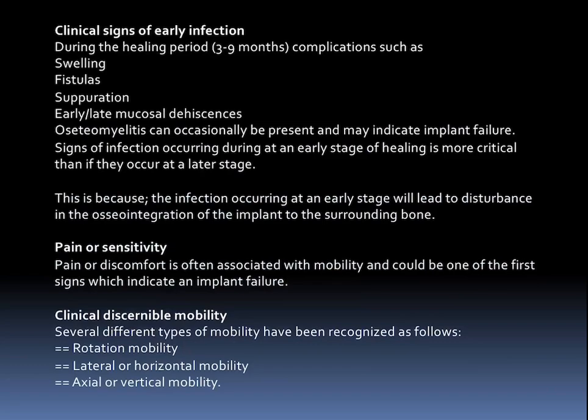The restorative failures can be due to pier abutments if used, and excessive pressure that can be due to a cantilever placed along with the implants. Also, the implant should never be connected in a bridge with the help of a natural tooth. There should be only implant connection.